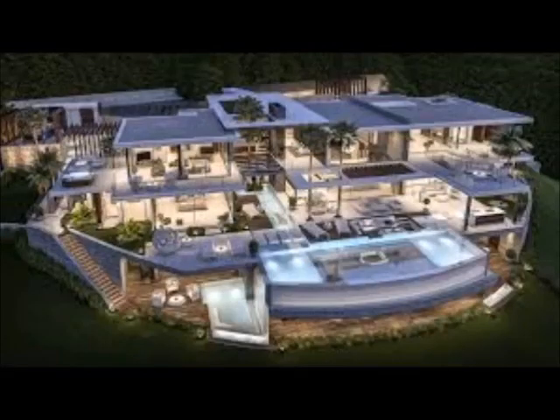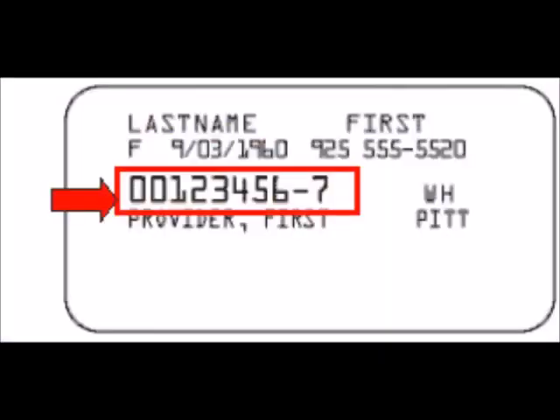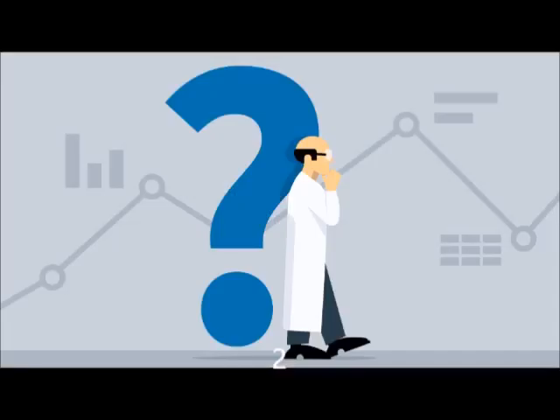he was home. He received a urine sample with an order, but the sample was missing the second patient identifying number, which was the medical record number. Should George have rejected the sample and called the nurse to request a new one?